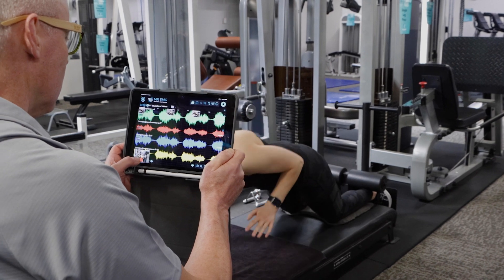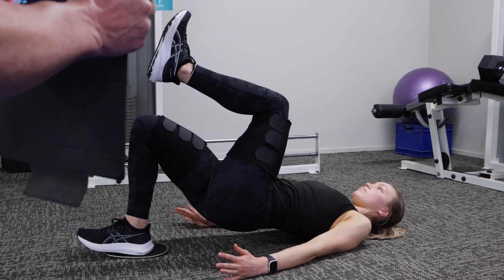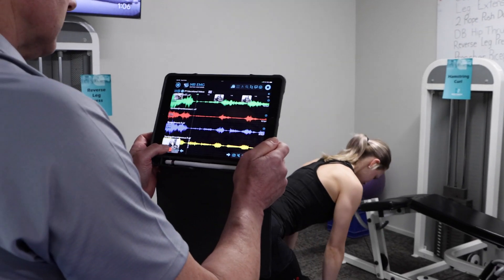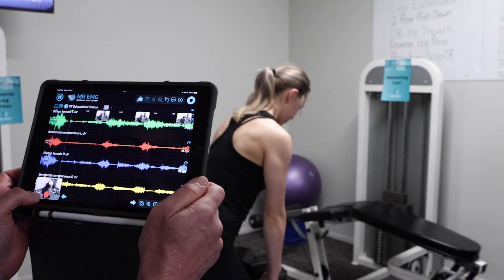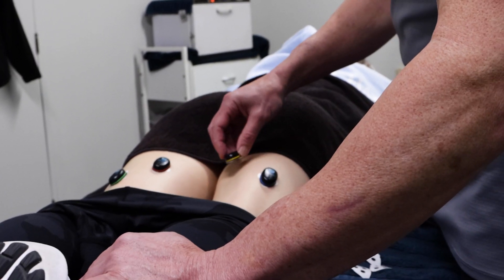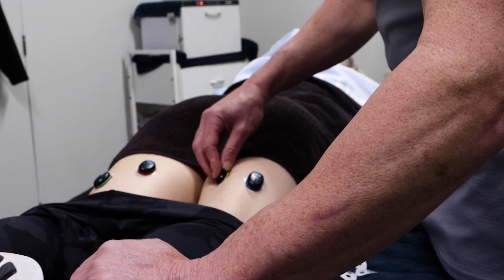There is an easy way to test which strength exercises work well for your client's hamstrings by measuring how well their muscles contract and how much they contract during a loaded movement. Place sensors on the biceps femoris and semimembranosus of both hamstrings.